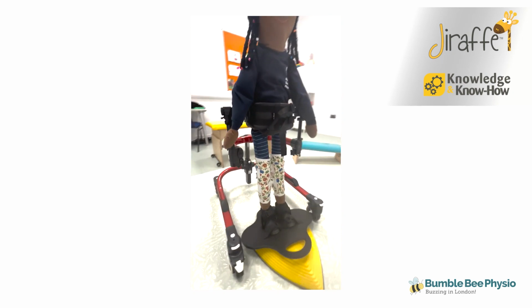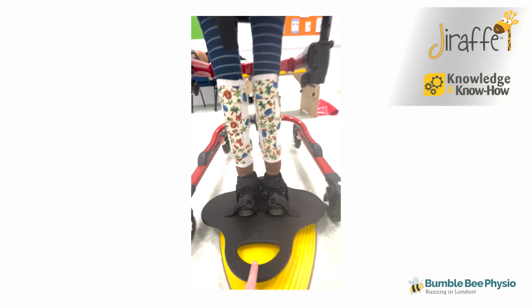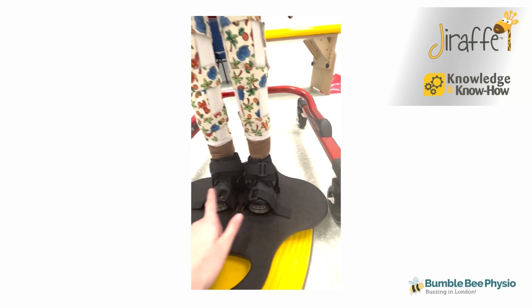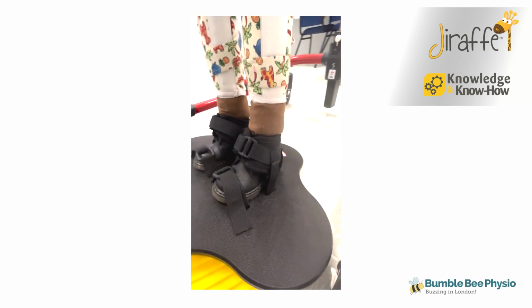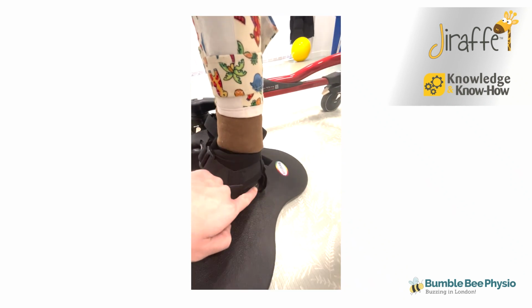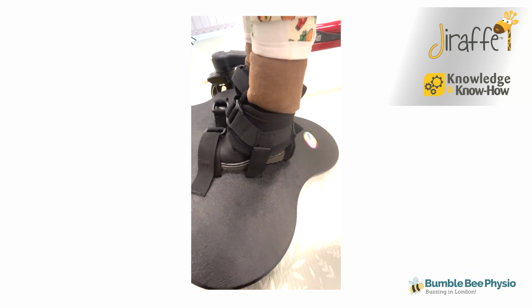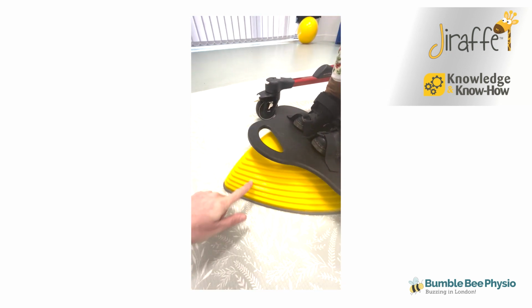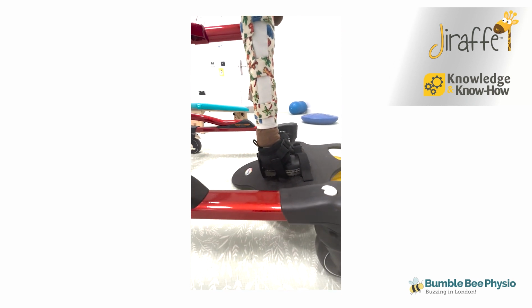So as you can see here, we've got the gaiters on to enable knee extension. We've got the short stand, which ensures that the feet are stable without the therapist's hands having to constantly be holding them. And we've got the heels down as well. You can adjust all of this to make sure there is full foot contact with the whole board. And then I've got it up on this stepping stone to get a wedge into there as well and to add some dorsiflexion.